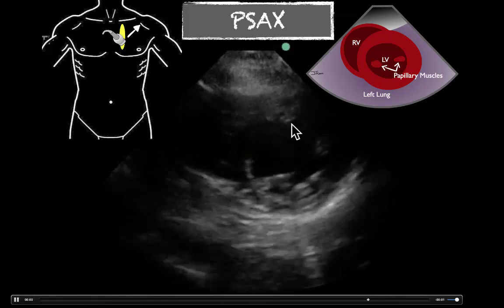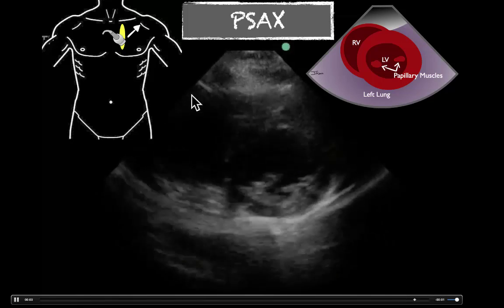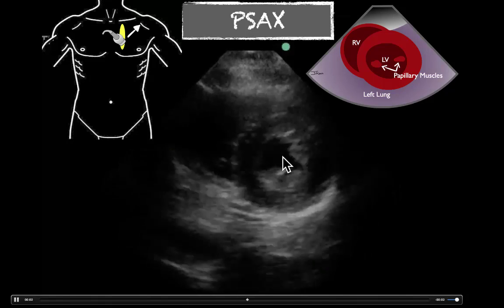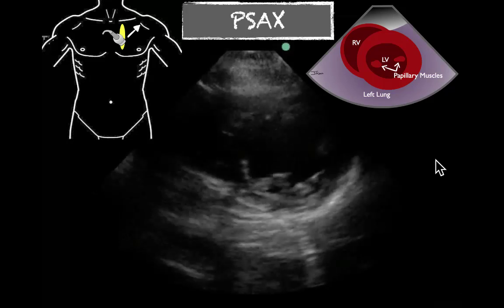We will see the left ventricle here. The right ventricle is just kind of wrapped right there, and we're not going to ignore it, but we're not going to pay as much attention. What we're going to do is think of a little dot being right there, and we're going to think in our minds how much that chamber collapses down.